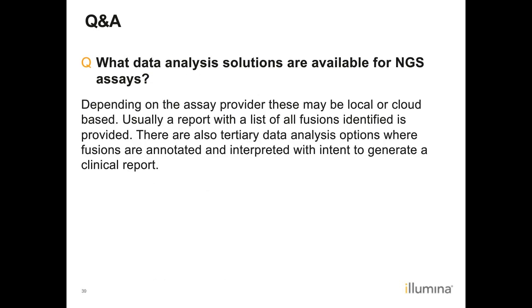What data analysis solutions are available for NGS assays? Depending on the assay provider, these may be local or cloud-based. Usually a report with a list of all fusions identified is provided. There are also tertiary data analysis options where fusions are annotated and interpreted with intent to generate a clinical report.